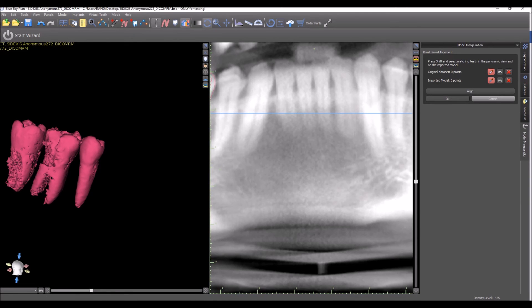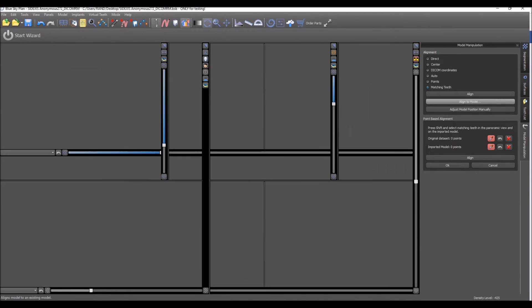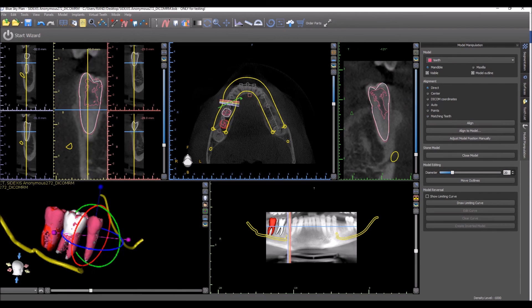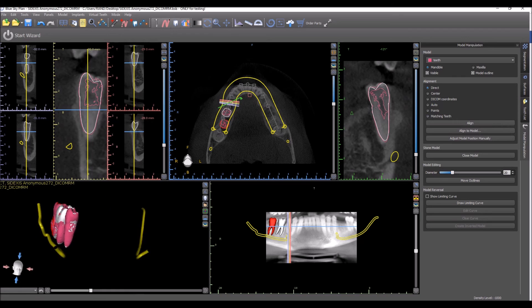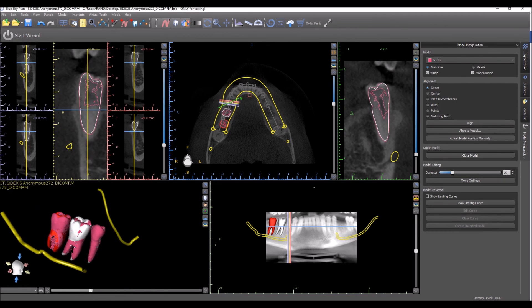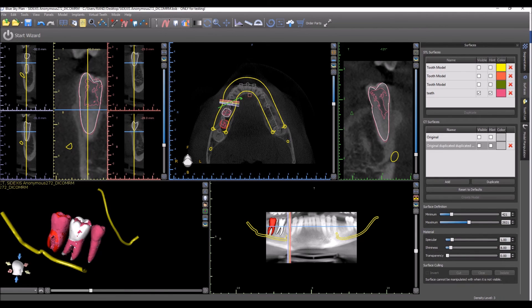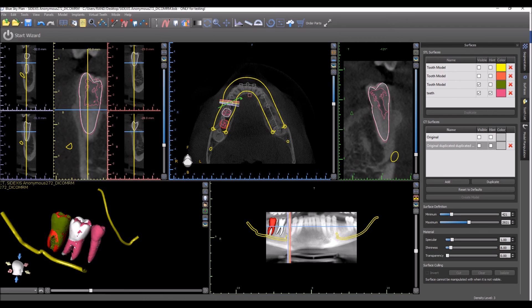Then when we go to imports, we import the STL model. When they were imported, they were imported directly into the exact location. So now in our surfaces, we have one surface with all the teeth grouped together, and we also have the individual tooth surfaces as well.